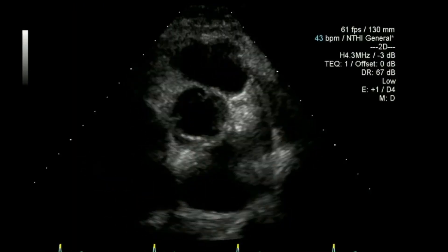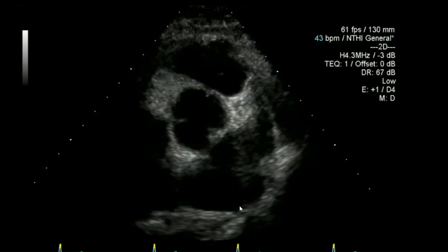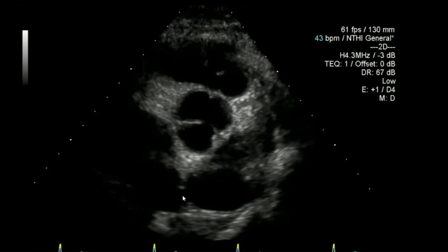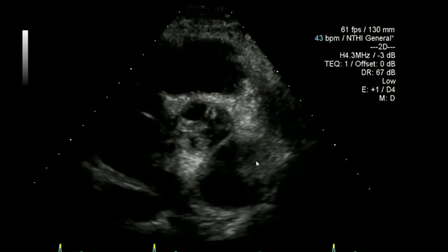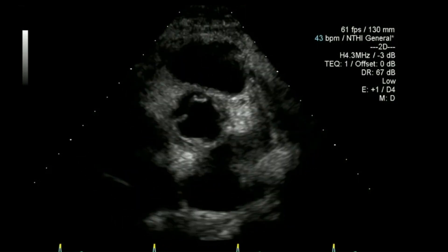Now looking in short axis at the aortic valve — again one to two centimetres behind the heart. I want the cavity to be as black as possible, and in this view you can also see the left atrial appendage.